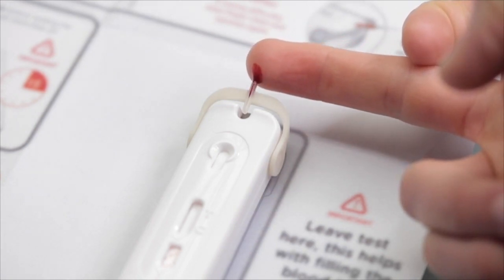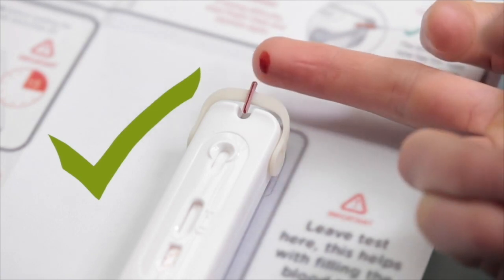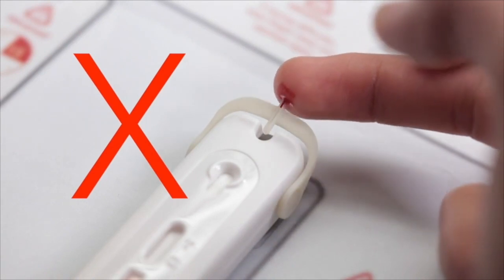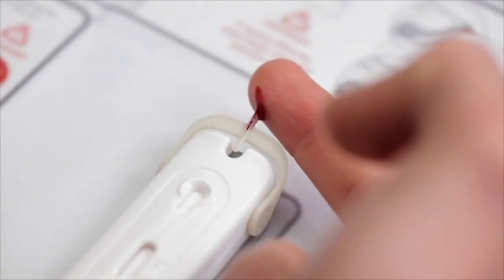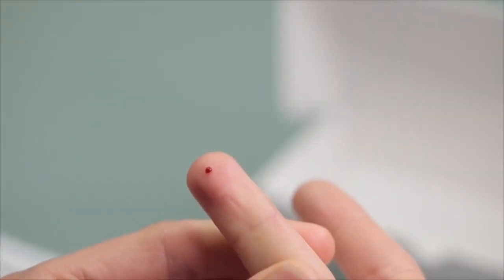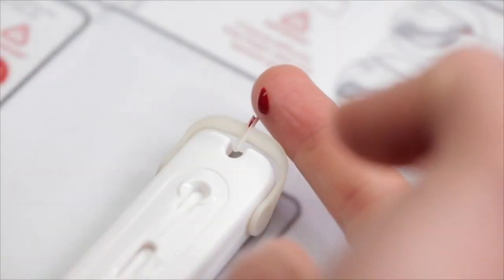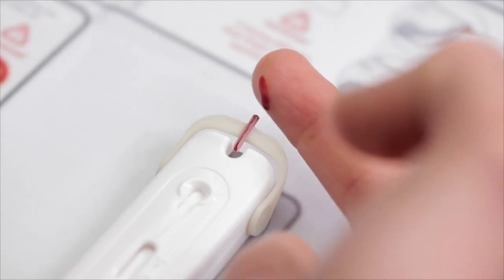Hold your finger in a downward position and gently touch the blood to the tip of the tube so that the tube fills with blood. Avoid touching the tube with your skin. Do not force the blood into the tube. If there is enough blood on your finger, the blood will be drawn into the tube automatically. If the tube is not full, squeeze your finger again behind the prick site. Now touch the blood to the tip of the tube to continue filling.